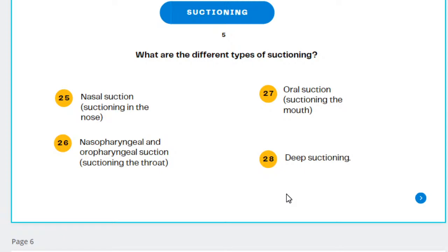For nasopharyngeal, we also have equipment. If you have a patient with a very delicate nose and you don't want to damage it, or frequent suctioning through the nose, you will use a nasopharyngeal airway. You leave it in the nose. That's what we call a nasal trumpet. Please take note and Google nasal trumpet.